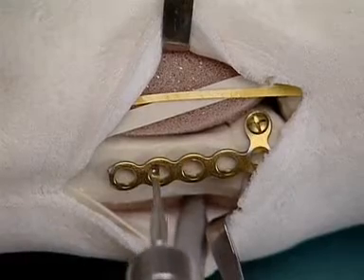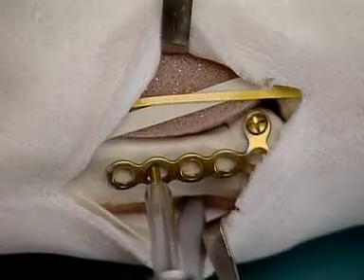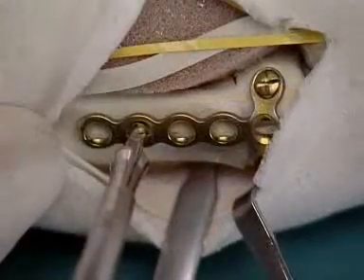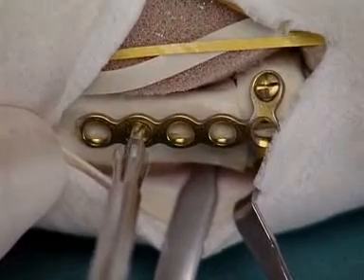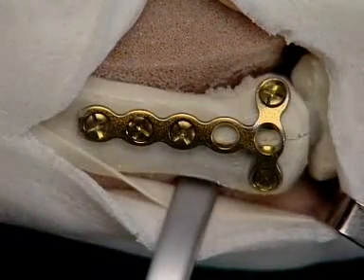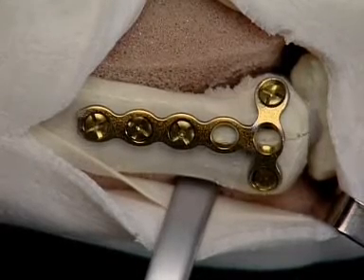After determination of the length, the appropriate screw is inserted. The final two screws are inserted through the plate in the neutral position.